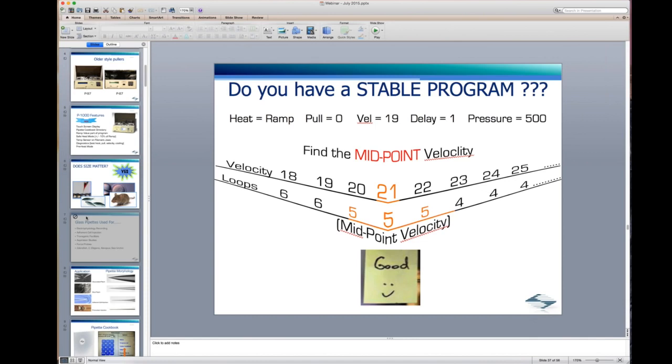You want to use a microforge and break it back to about 5, 6, or 7 microns ID. That's the traditional size of a sperm head, and then you normally will bevel that pipette, and then you'll put a spike on it.